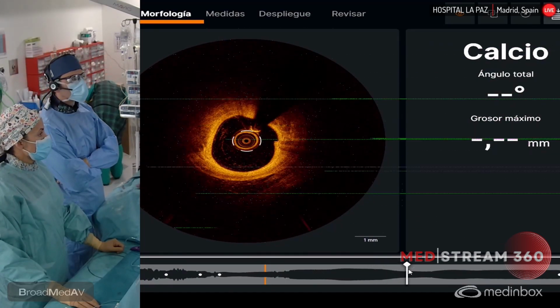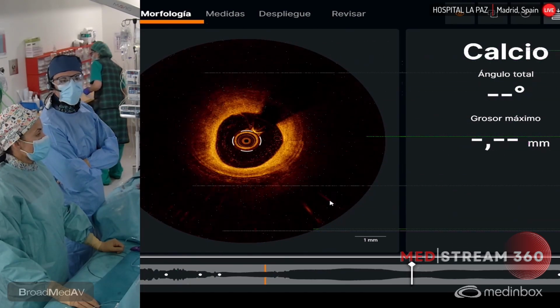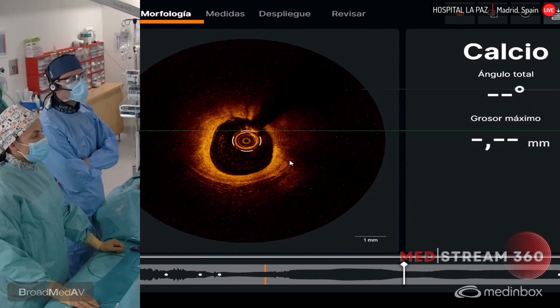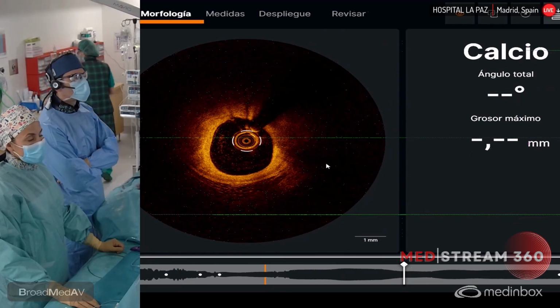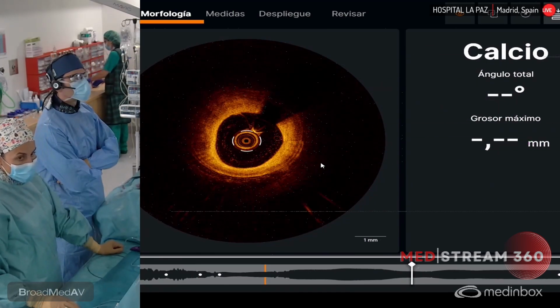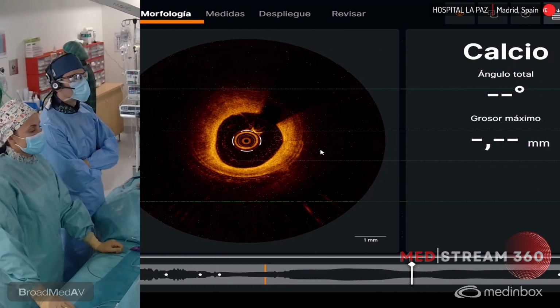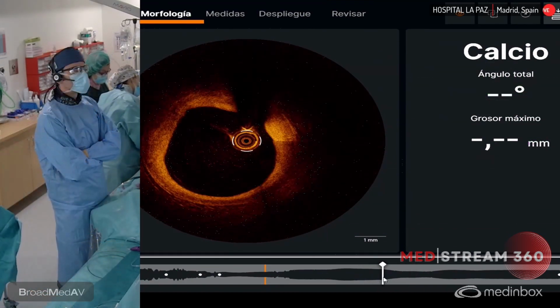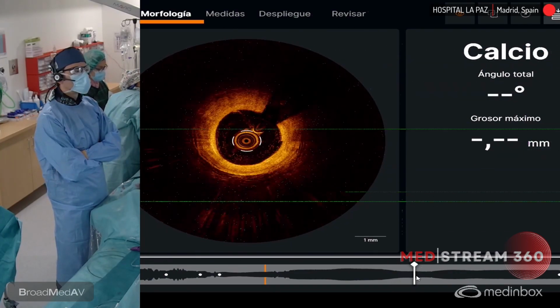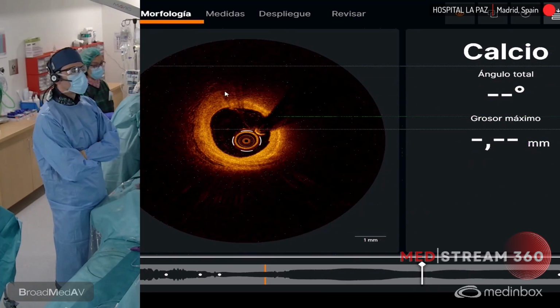And at some point we need to measure the thickness of the fibrous cap. So the first criterion, I think, is fulfilled? It's lipid, yeah, it's a lipid plaque. In this case, more than 270, nearly 3 quadrants. Okay. And at some point, the fibrous tissue is nearly in contact with the lumen, so probably it's a thin cap fibroatheroma. To measure the plaque burden, it's a limitation with OCT at the point of maximal stenosis, because the lipid tissue does not allow it.